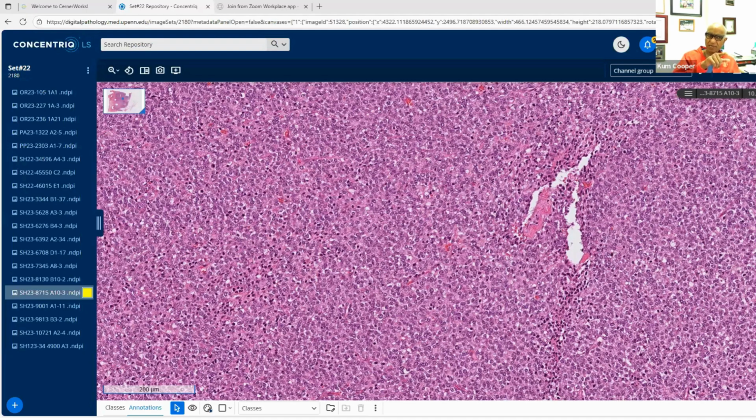Again, if you've got EWSR1, remember, this is now a promiscuous gene, because unless it's Ewing sarcoma, where you have classic morphology and diffuse CD99 in the right setting, for all the others, if you're getting EWSR1 on FISH, you've got to get the partner. You cannot make a diagnosis. You've got to find out what the partner is. Look, we've already got two partners here that are promiscuous in that context.